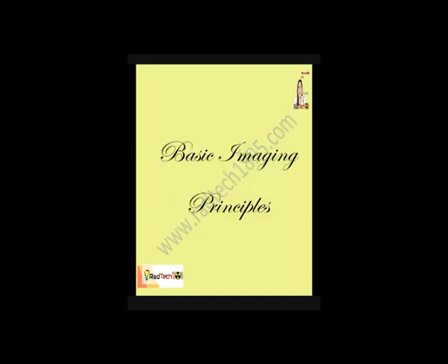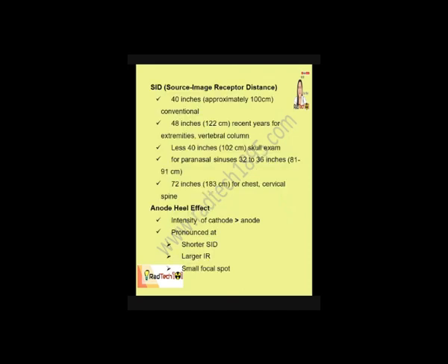So, next we have the basic imaging principles. SID, or the source to image receptor distance. Another term for that is the FFD, or the focal film, may dash siya kasi focal to film distance. Actually, this is not focal, it is a focal spot, so from the tube or from the source. Pareho lang ibig sabihin. Film is the image receptor.